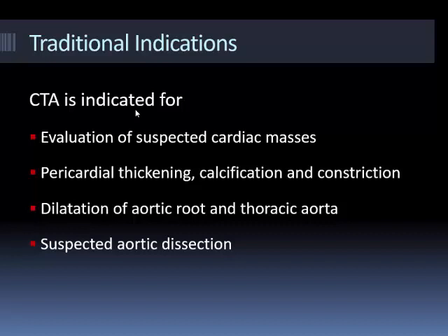Looking at the aortic root, looking at the thoracic aorta, obviously CT is the gold standard, and similarly in dissection. Whether you choose to then follow patients up with CT is arguable because you can do it with MR, but it's always worth doing one CT just because you get nice volumetric data. The surgeon can appreciate where there's calcification, where there's not calcification. You can obviously get the volumetric data from MR, but you won't get the information as to the calcium, and you won't appreciate the atherosclerosis to the same degree, I would argue.